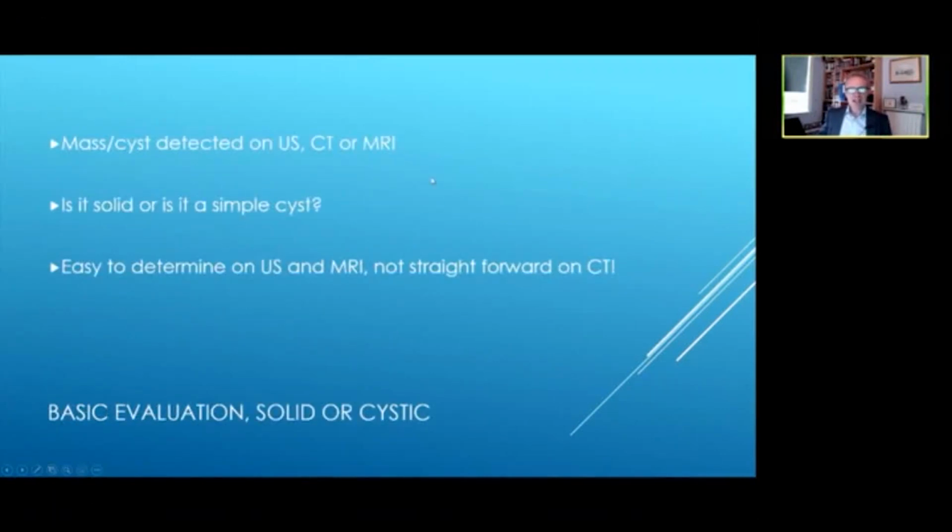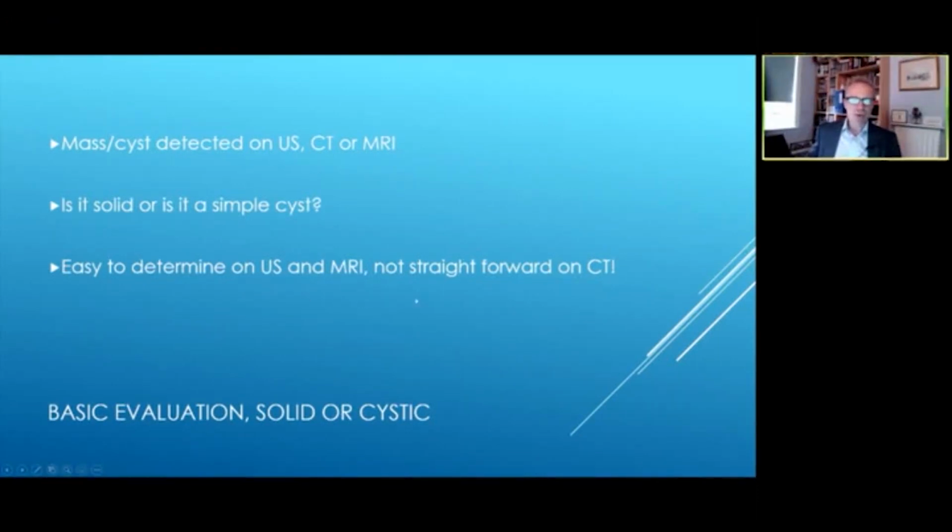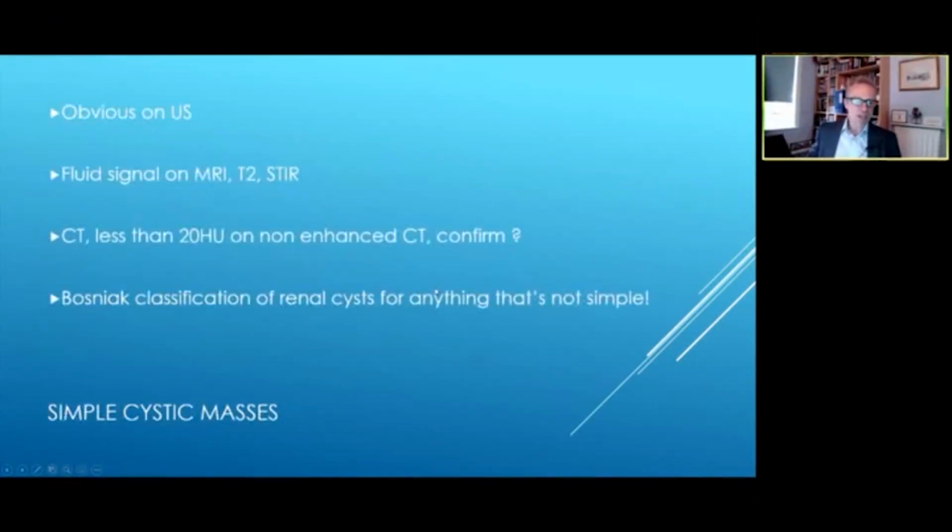A lot of these are detected incidentally on ultrasound, CT or MRI. Virtually every patient comes in at the hospital these days and has some form of cross-sectional imaging. So you need to decide, is it a solid or is it a simple cyst? This is very easy to determine on ultrasound and MRI, but it's not always straightforward on CT.